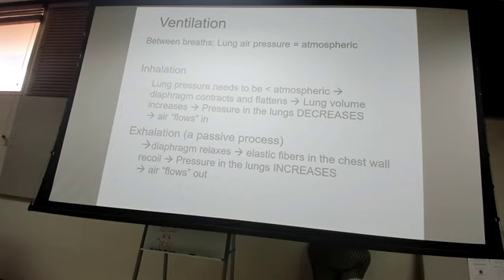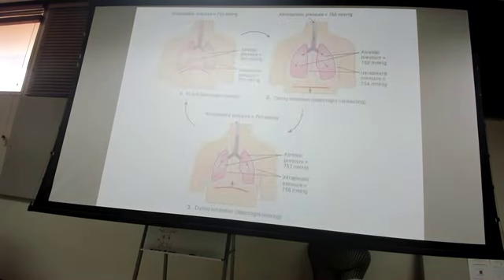So all of the ventilators we use nowadays are positive pressure ventilation, doing the exact opposite of what the human body does. We're pushing air into the lung, whereas naturally we pull it in. You guys remember iron lungs? That was negative pressure ventilation, where you put somebody in the cylinder, draw negative pressure, pull down on the diaphragm, and the air would actually go into their lung. You wouldn't have to intubate them. Just another diagram of that.